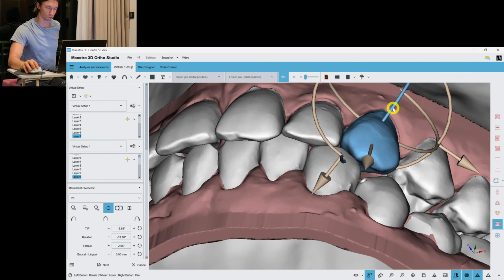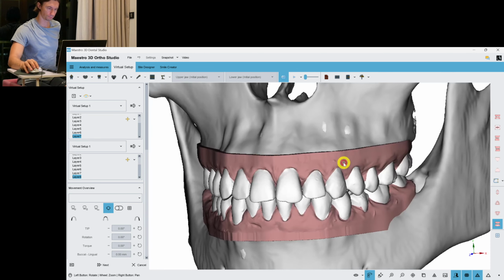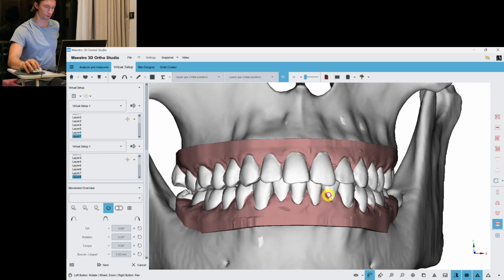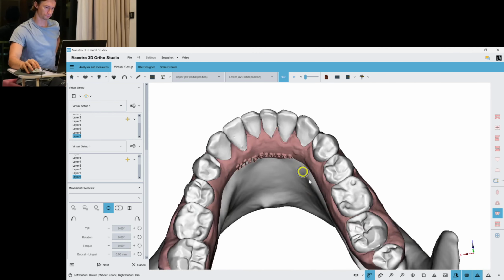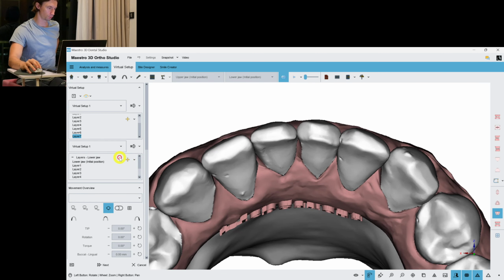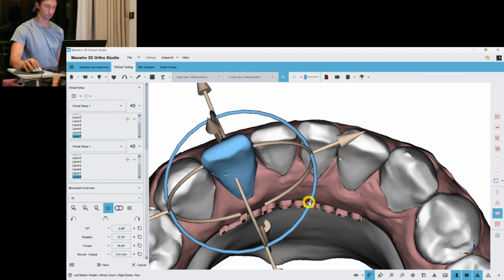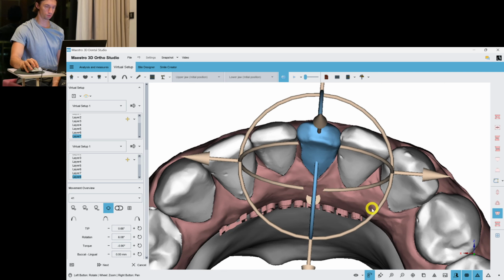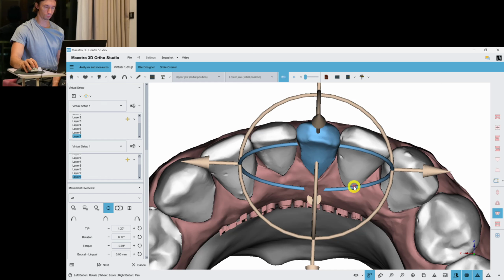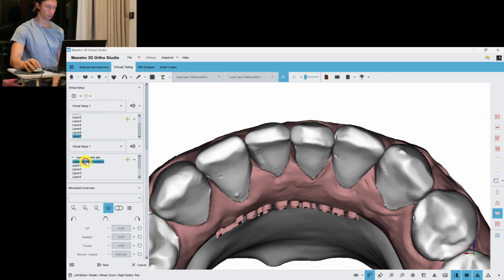We can tip the canine more so that it reaches the antagonist tooth. Okay, I think we can finish. And check the overcorrection. Let's add some intrusion here. And yes, it's time to check the overcorrection. Let's go to layer 0. So the laterals was more lingually, so that I have to be more vestibular at the final position. And we apply the opposite logic to the central incisors. So since this tip was more vestibular, we put it more lingually for 5-10%, but it's very crucial.